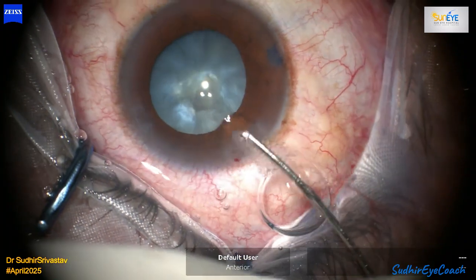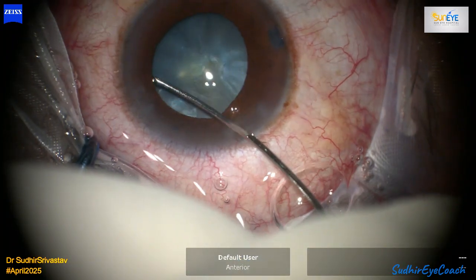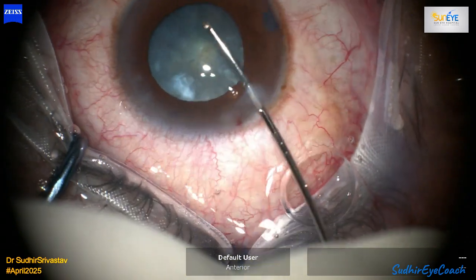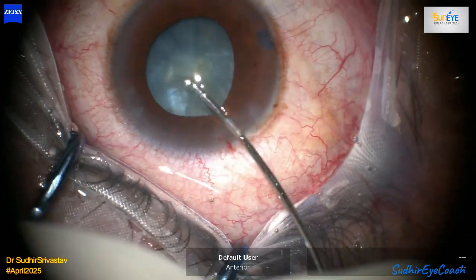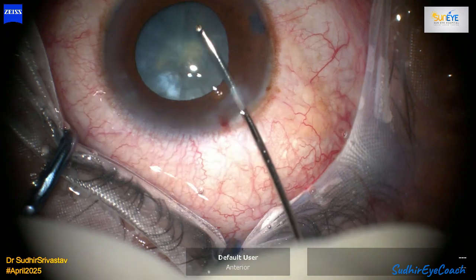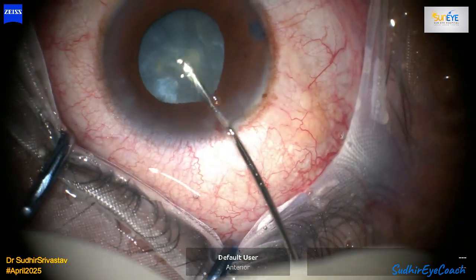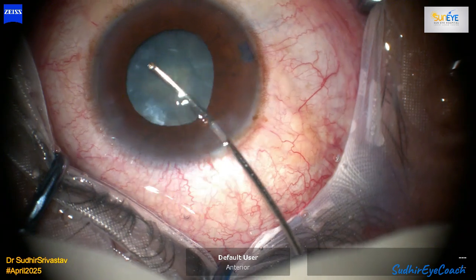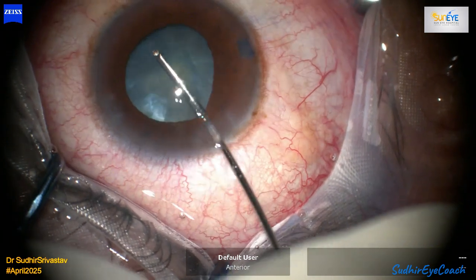However, during the implantation, the trailing haptic broke inside the cartridge and only one haptic entered the eye. At this moment, there was only one option: remove the lens and implant a new one. While the staff went to search for a new IOL of the same power, I considered an alternative — optic capture through the anterior capsular rhexis.